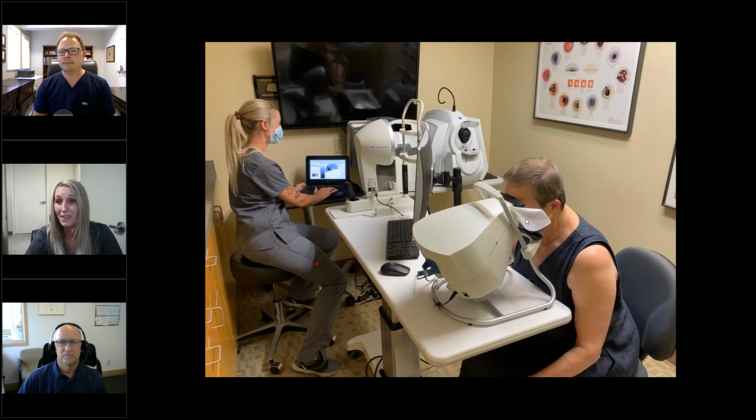Yeah, the only thing I would say with the OCT is when they are older and they're not looking where they're supposed to be, there's a whole bunch of problems. They have to bring another tech in. They have to hold their head. With the Smartfield, I don't have to do that. I don't have to bring another tech in if they're a problem child. But with the OCT, I would.